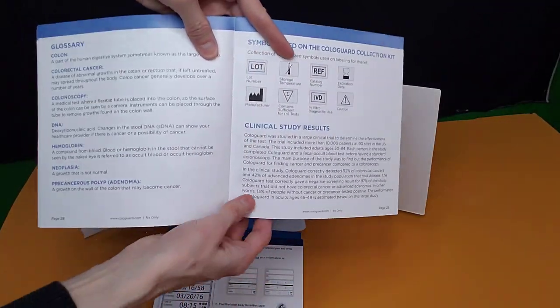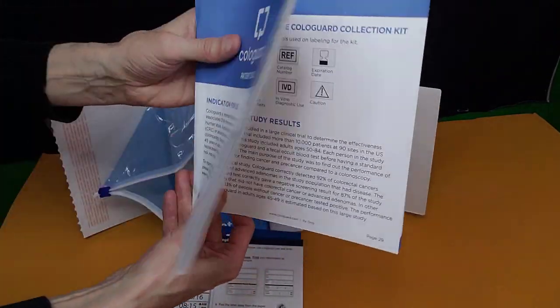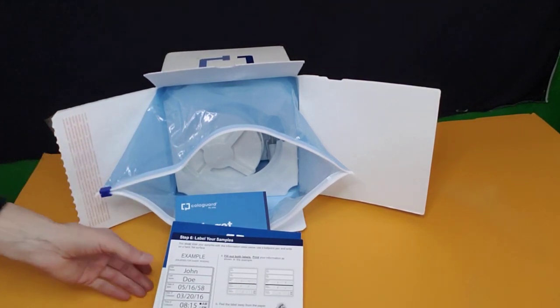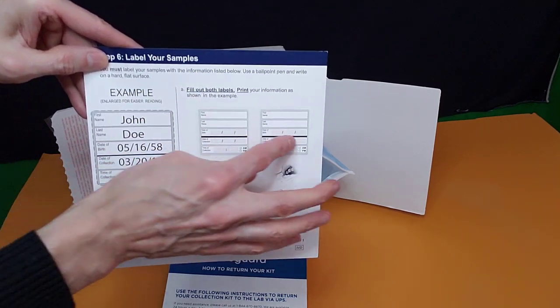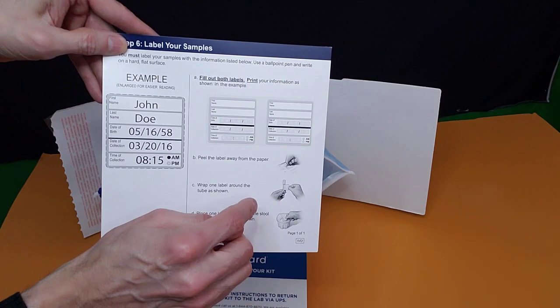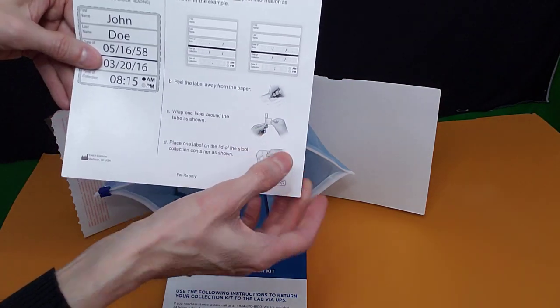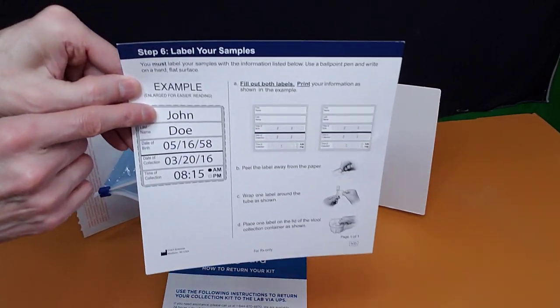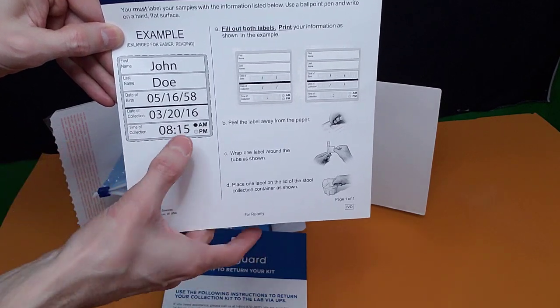Then you're going to take it to UPS and they'll pick it up and take it to the lab, which will only take a very short time for the results. Also, what comes in the box: you have the labels — they're stickers that peel off. You're going to put one label around the little collection scraper and then one on the lid of the container. Here is how you fill them out: your name, your date of birth, the date of collection, and the time of collection.